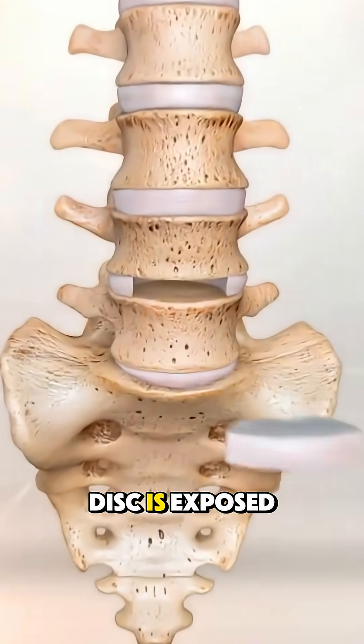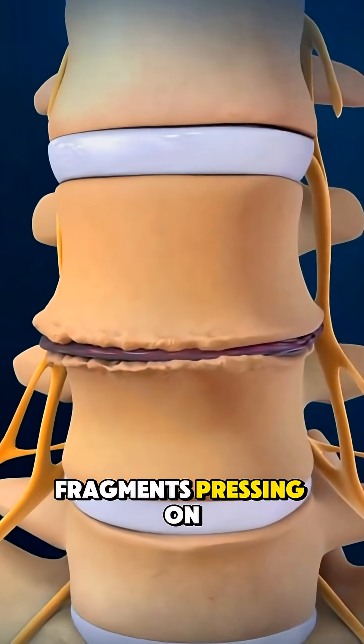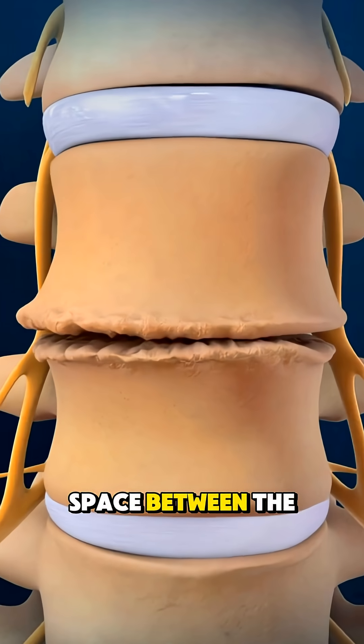Once the damaged disc is exposed, the surgeon carefully removes it, clearing out any fragments pressing on nerves and preparing the space between the vertebrae.